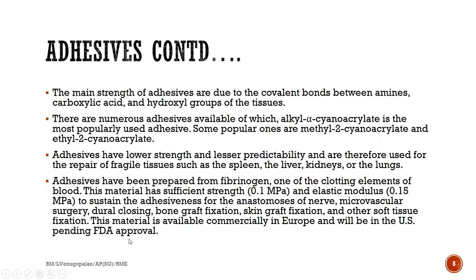According to your book, this adhesive material is available in Europe, and the FDA approval is still pending in the US. So a bit of an assignment for you guys. Please go and check if this material is commercially available in the US, just for your general knowledge.